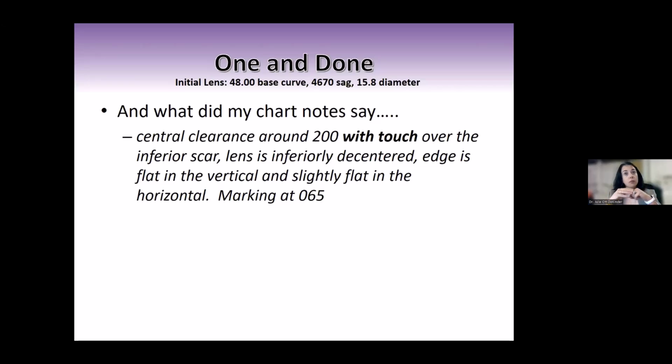So if patients come back and they've had the lens on for 8 hours or 4 hours and you've got touch, is that touch or is that touch, right? You don't know. So it's very, very hard to figure out how much central clearance you got to increase so that you don't have touch anymore.